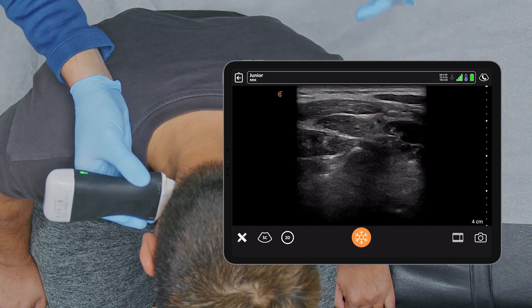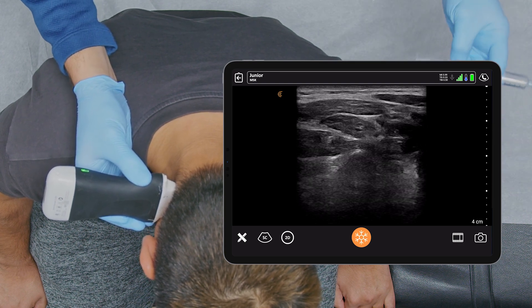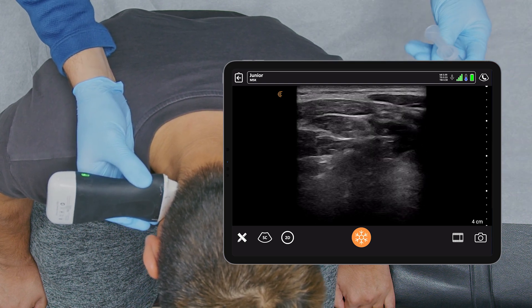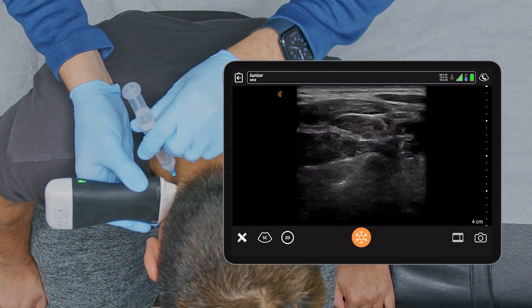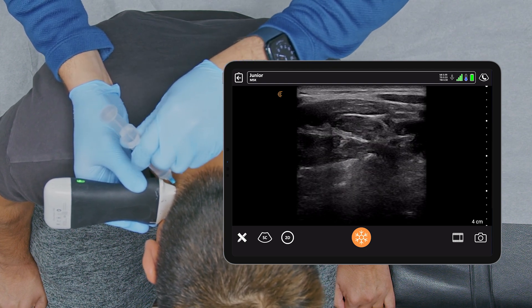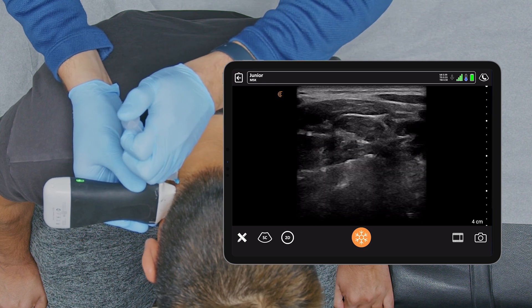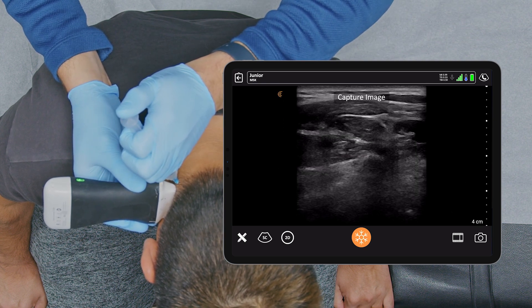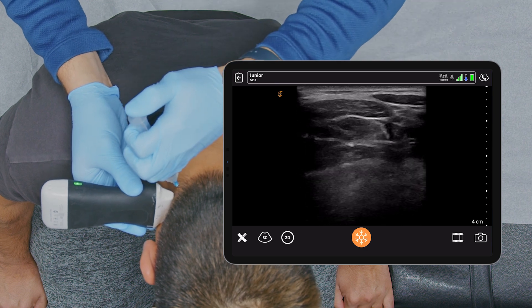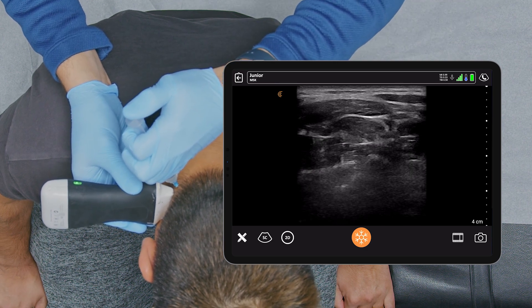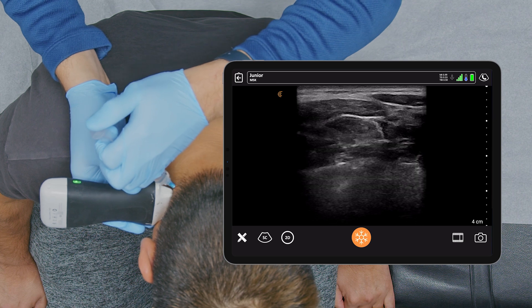This is not purely a diagnostic block where I'm just doing one thing — I'm just trying to get him out of pain. The needle is right above the articular pillar.